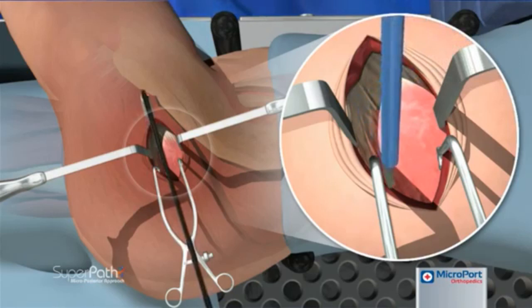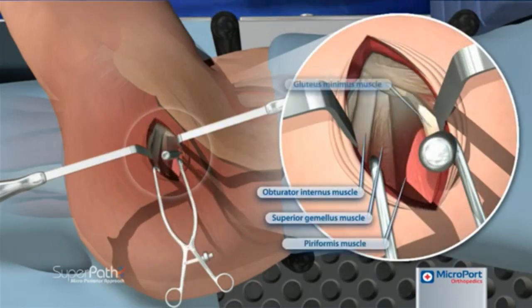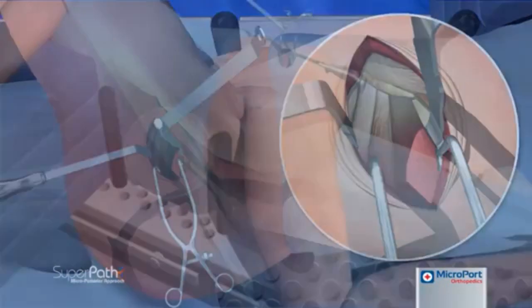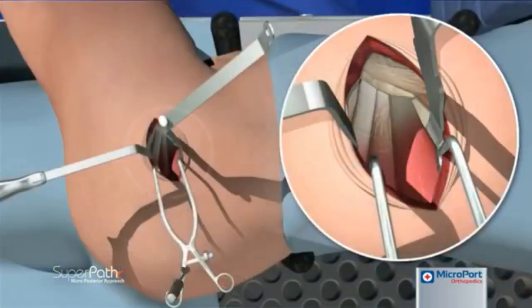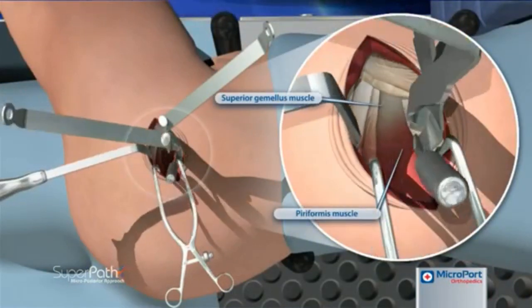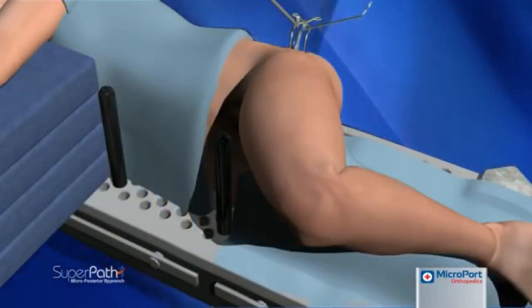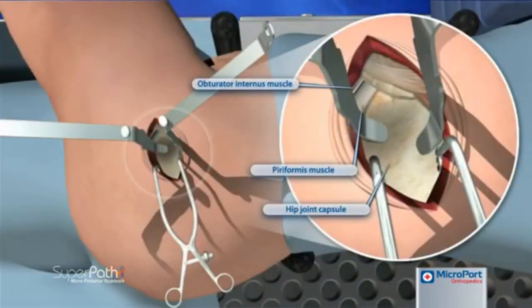After careful incision of a very thin layer of the bursa tissue, a cob elevator is placed under the gluteus medius. The cob elevator is then replaced with a blunt Hohmann retractor using gentle pressure to maintain the position in the interval between the gluteus medius and the gluteus minimus. With the hip abducted and externally rotated, a cob elevator is placed between the piriformis tendon and the gluteus minimus. The cob elevator is then replaced with a blunt Hohmann retractor and the knee is lowered to return the leg to the home position. Gentle pressure is used to maintain the retractor's position between the posterior capsule and the external rotators.